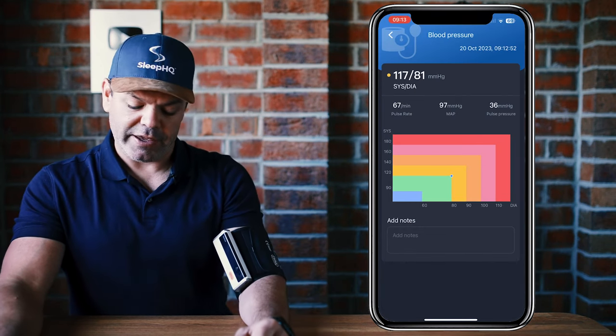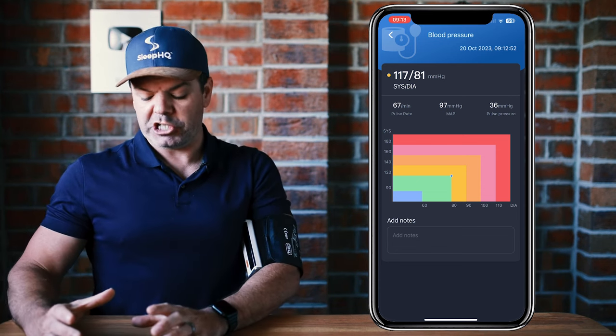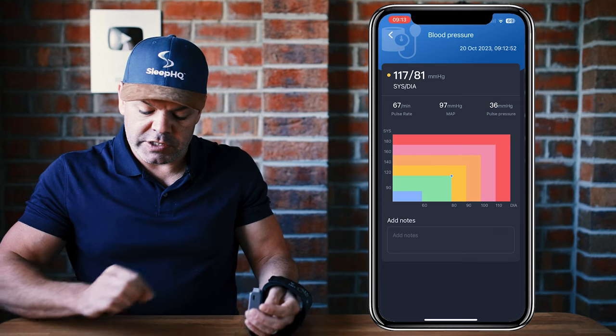And it's as simple as that — 117 over 81. It provides a nice color-coded chart to give you an idea of where you are in the range. Pretty good! You can also add some notes if you like.